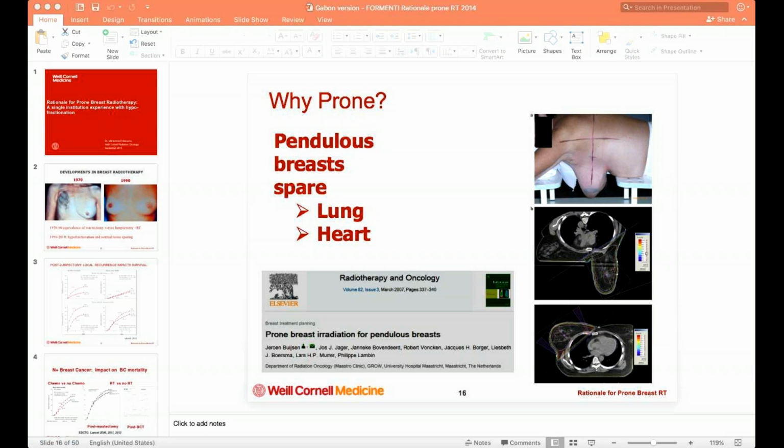So that's one thing. Does the scar length also affect the contouring for the tangential field, and how do you make up for the very extensive mastectomy scar? It does affect your tangential field if it extends, hopefully it's not crossing the midline.